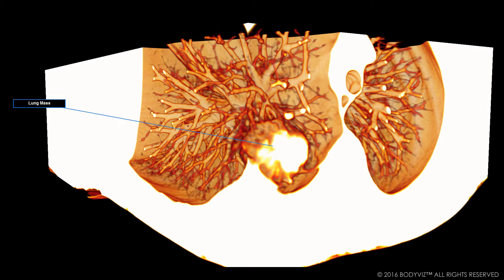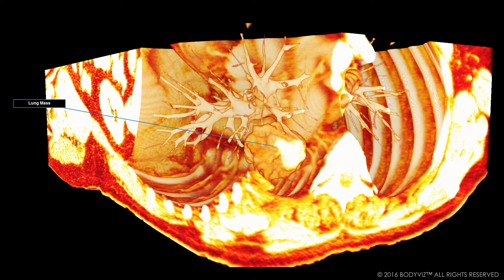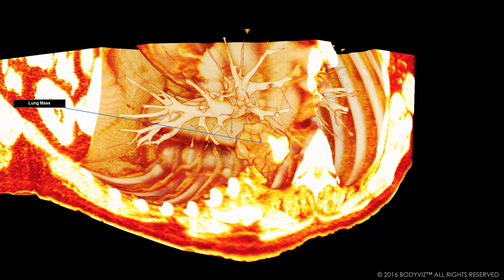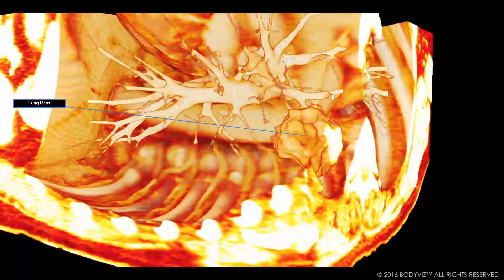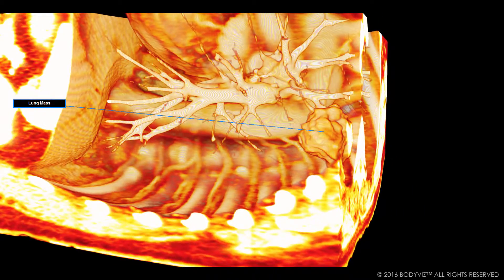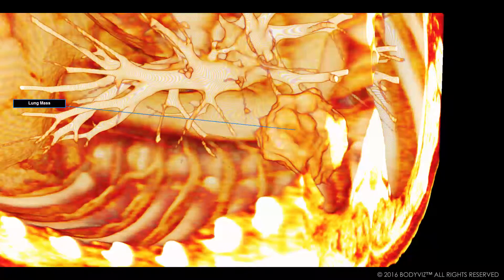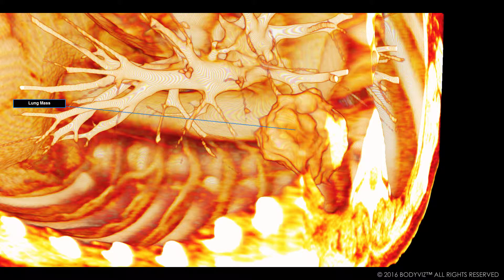If I want to look at just the bones, I can do that. If I want to look at the bones plus blood vessels and organs, I can do that too. Based on the appearance and location of this mass, this patient is likely suffering from non-small cell lung cancer. This is one of two common lung cancers that affects more than 200,000 people in the United States each year.